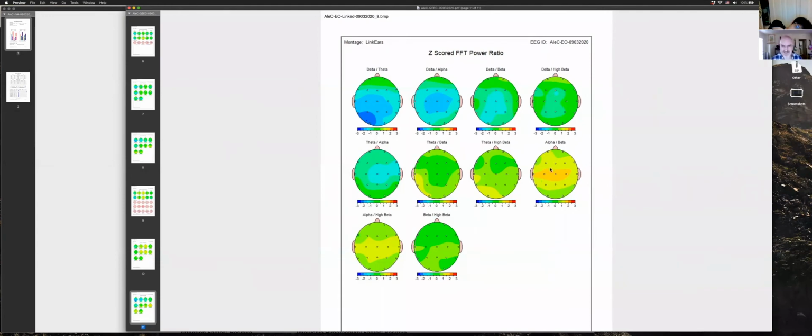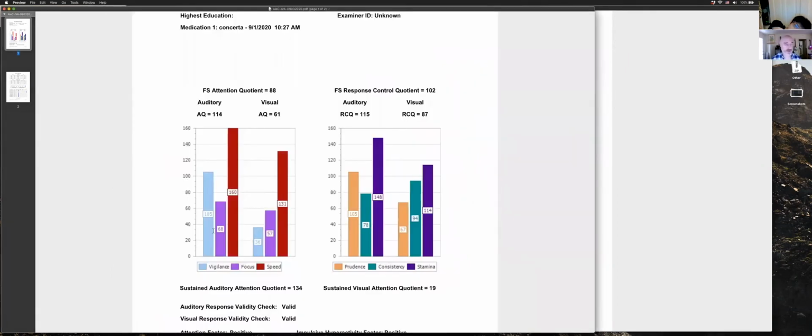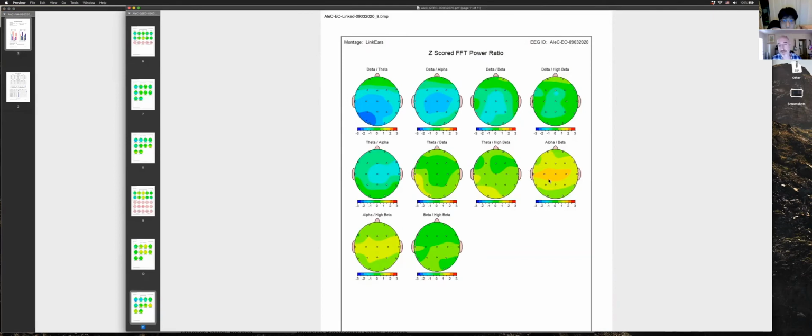So you have a hint of attention difficulty and a big, obvious thing with sleep and anxiety. And then you have some scores that are amazing on your attention and some things that are iffy. But the things that are iffy, like focus and prudence, can be explained by your brain being extra sleepy. So I think you have a little ADHD, like a 2 out of 10, enough to get the benefits maybe. But then you're so unrested and so cranked up to compensate that you're anxious, you're wired and tired, and you're a bit brittle.